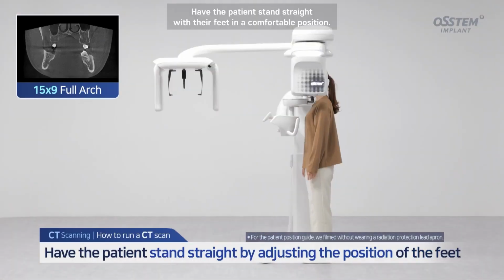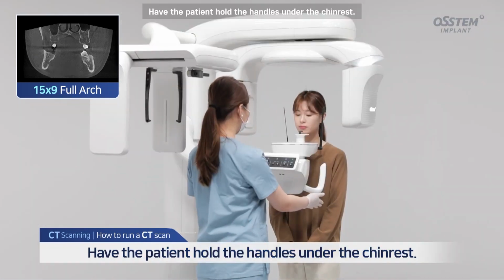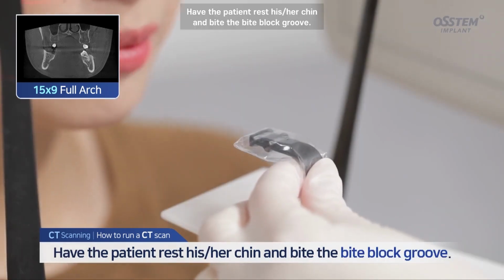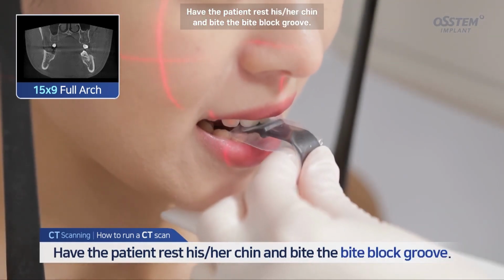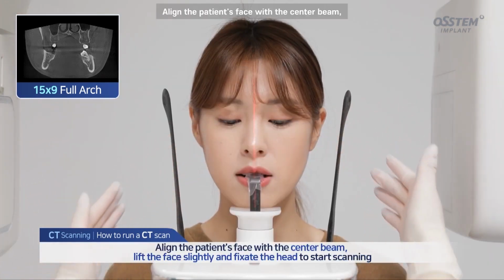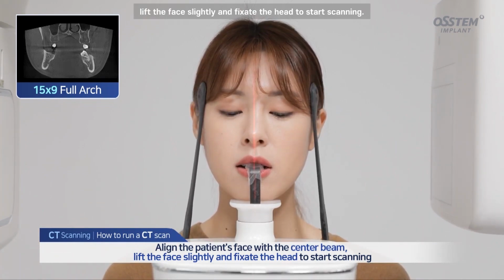Have the patient stand straight with their feet in a comfortable position. Have the patient hold the handles under the chin rest. Have the patient rest his/her chin and bite the bite block groove. Align the patient's face with the center beam, lift the face slightly and fixate the head to start scanning.